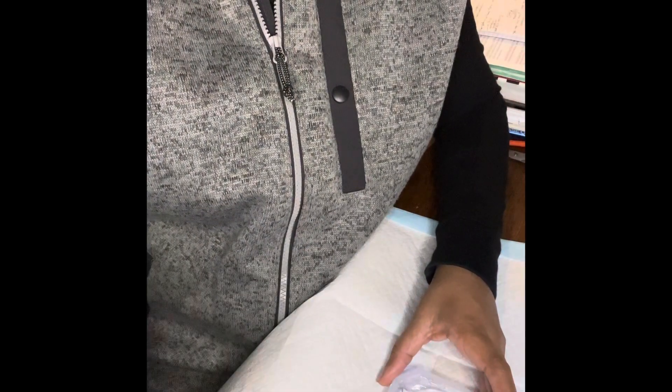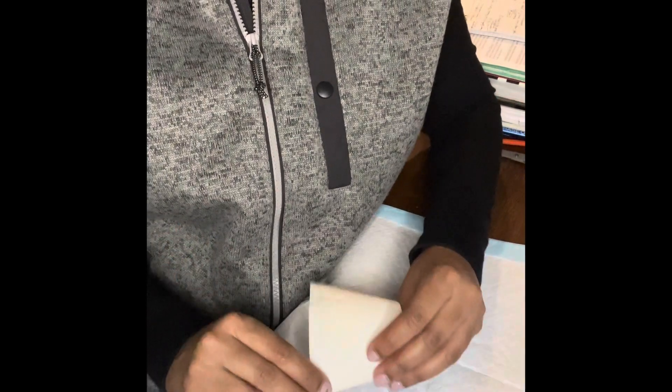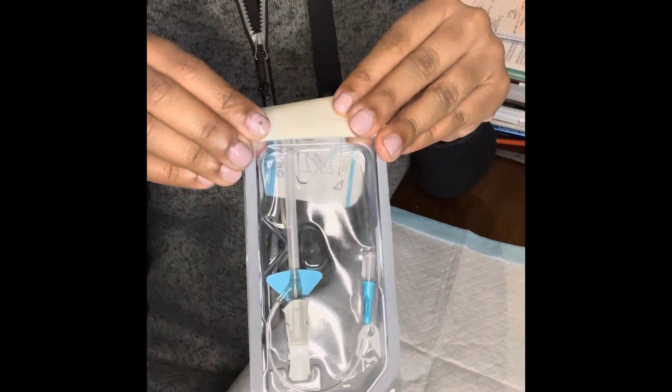Hey everyone, it's Tiffany here with Drip Infusion Bar, coming with two quick tips when using your Nexiva single port catheter: number one, maintain your closed system, and number two, increase your first time stick success.